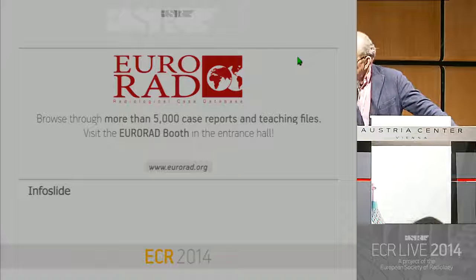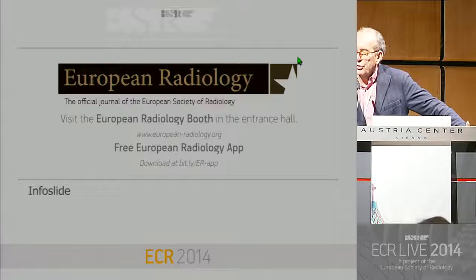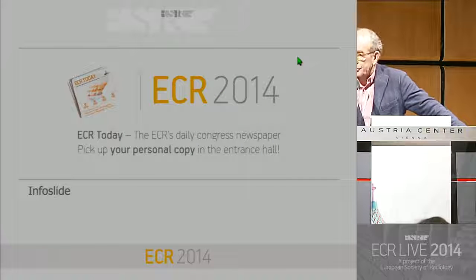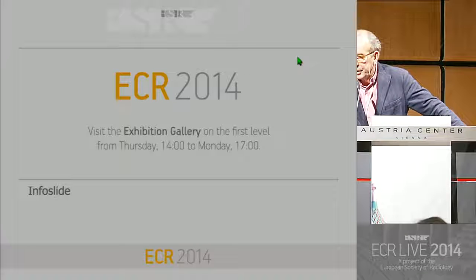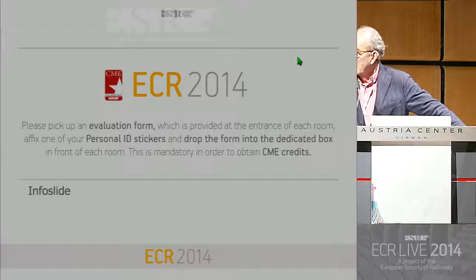At the base of the prostate, if you want to improve your accuracy in early detection of seminal vesicle invasion, you should use DCE, unless you have a very good eye on diffusion. But I think it's still too early to say that you can drop DCE for staging purposes at the base of the prostate. The data are lacking.